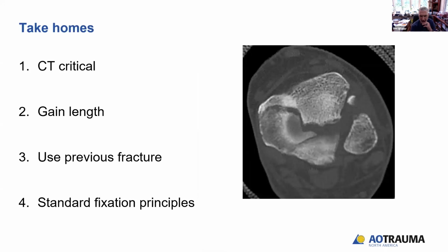Well, she's lucky she had you. Can I just ask a quick question on that medial fragment? How did you see that? Did you externally rotate the posterior fragment to then be able to see and clean out that medial fracture line there?